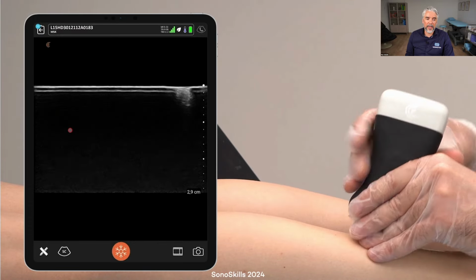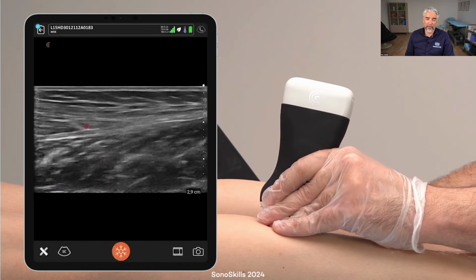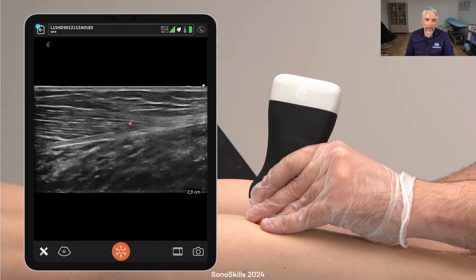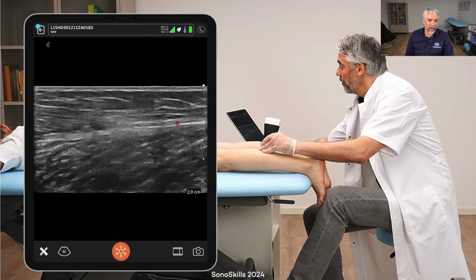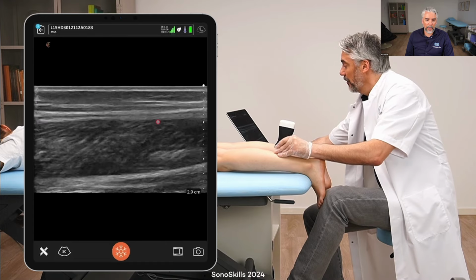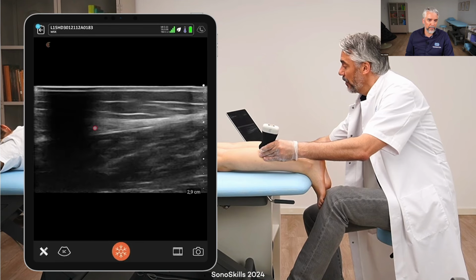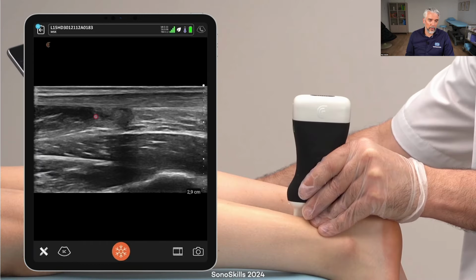This is the medial gastrocnemius, and that is a famous spot also for lesions. So definitely look at this calf muscle, this medial gastrocnemius head right there. You can see also that the medial gastrocnemius has a very different muscle architecture than the underlying soleus muscle. Yeah, that is indeed a famous spot for pathologies. So the gastrocnemius aponeurosis is really thin, going back down to distal, and you could do the same procedure also going towards the lateral gastrocnemius. And we're doing the same thing, also observing those muscle fibers.